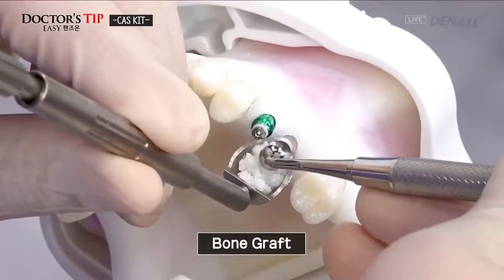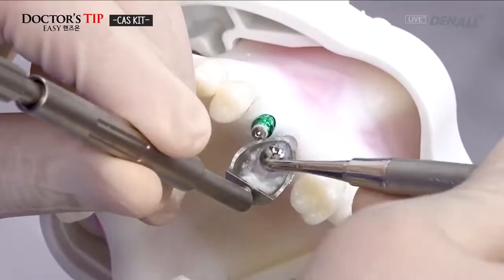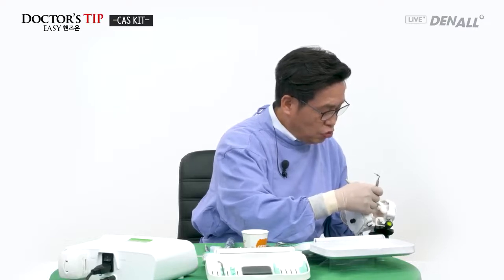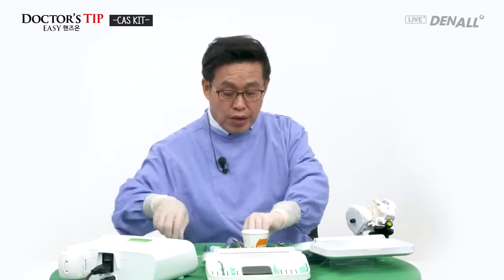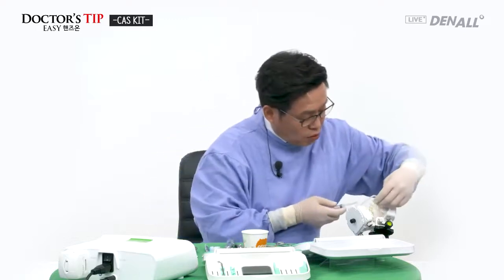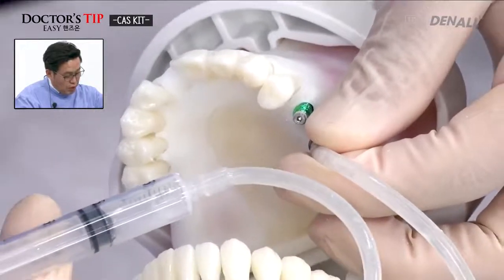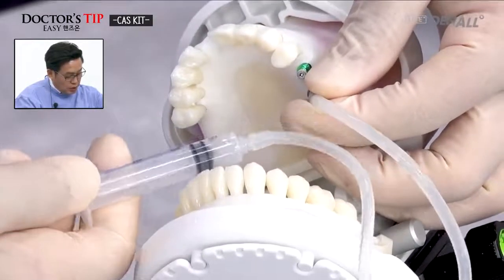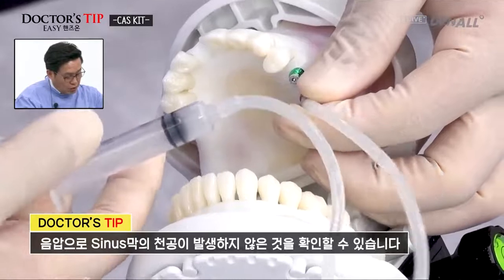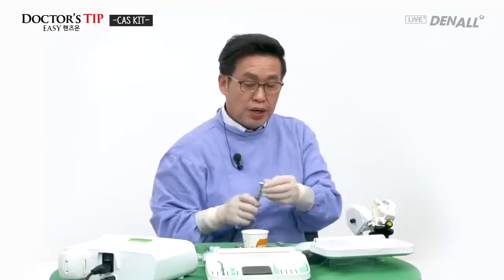Bone material is inserted and it is pushed in with the bone condenser. Due to the hydraulic lift, the water is coming out. In this case, as I explained, the hydraulic lifter is connected and aspiration is done. The water and bone materials are coming down. Due to negative pressure, it cannot be suctioned very freely. Perforation is not made, as you can see here.